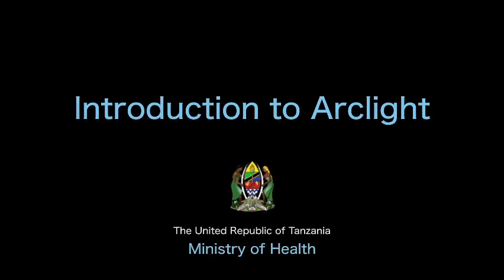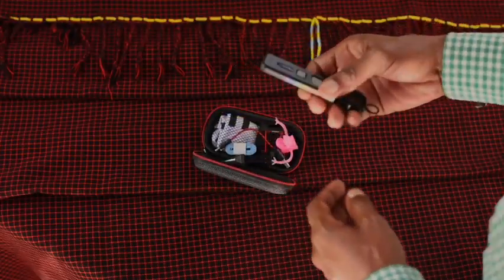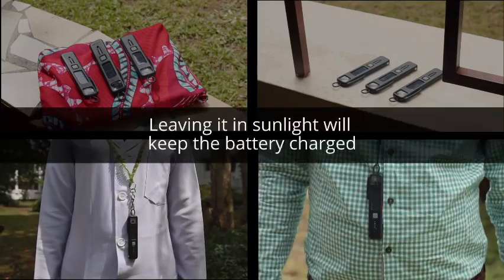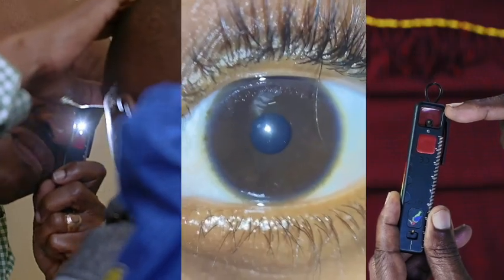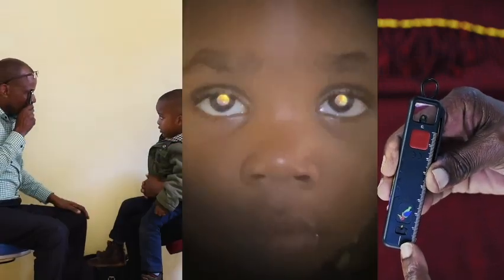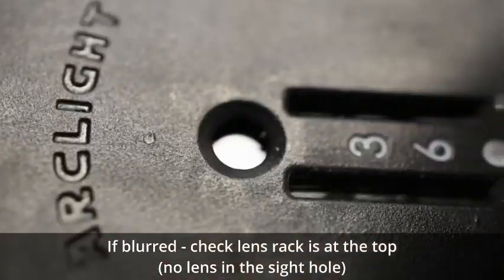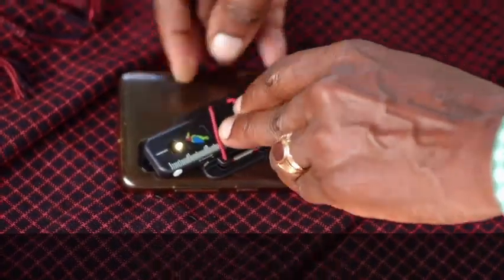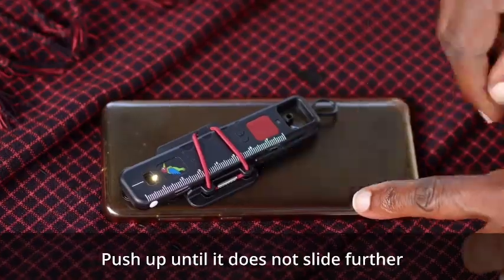This video summarises the content and structure of these materials, which can all be found on the Arclight project website and YouTube channels. Firstly, an overview of the device and how to switch it on and what end does what, emphasising that there are 2 ends, one an anterior segment loupe and the other a direct ophthalmoscope. Then an explanation of how to attach the Arclight to the camera of a mobile phone to capture video of clinical signs for teaching and telemedicine purposes.